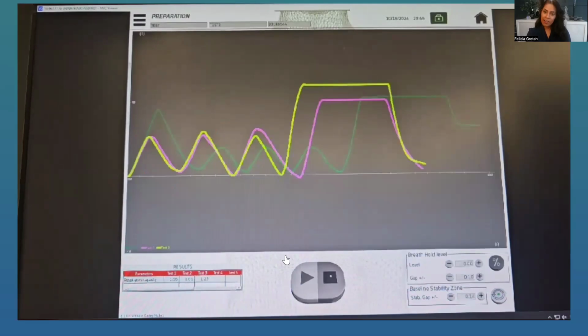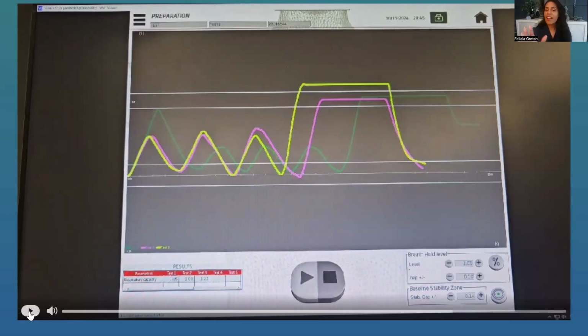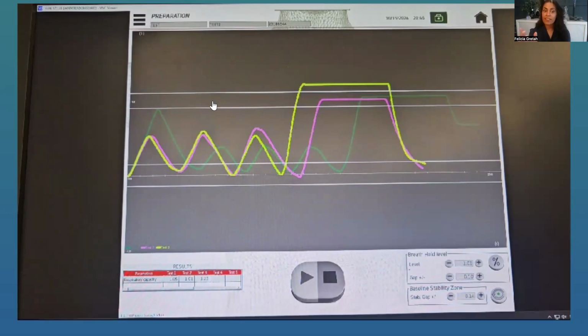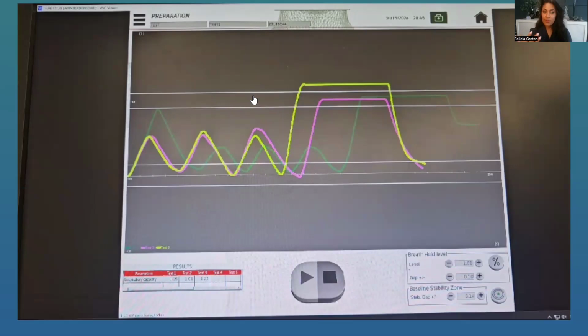This young one is kind of an outlier. So when we choose our phases, we are going to choose something that's kind of in the middle of where everything lands. And so in this bottom screen to the left, if you were to double click the phase that you want, it's going to create this separation. This separation is going to represent that green bar that the patient will breathe into later. Now, if we look at this separation, our default is 0.1.